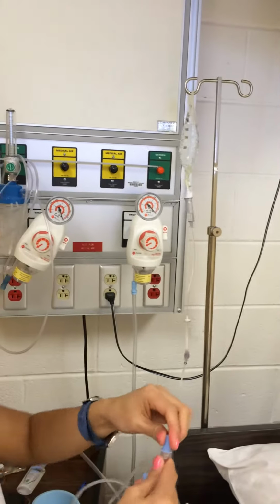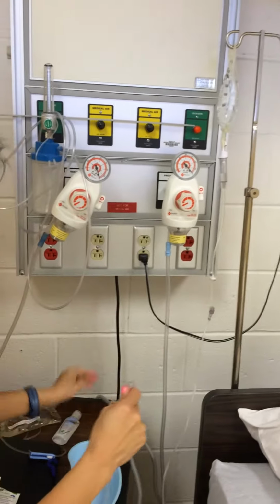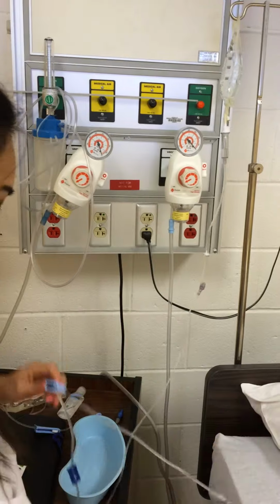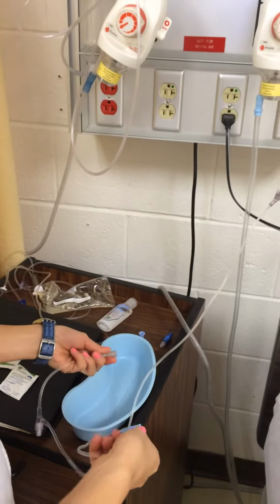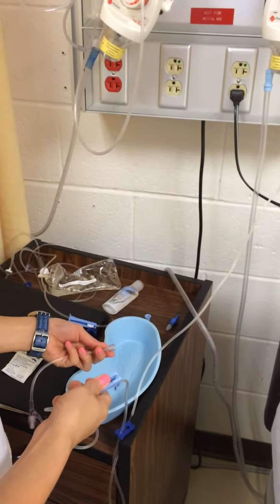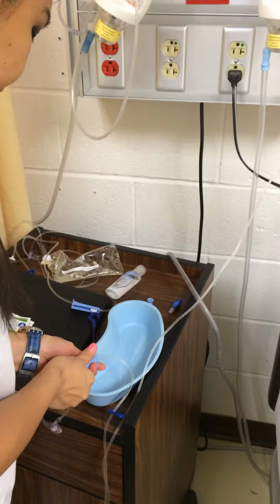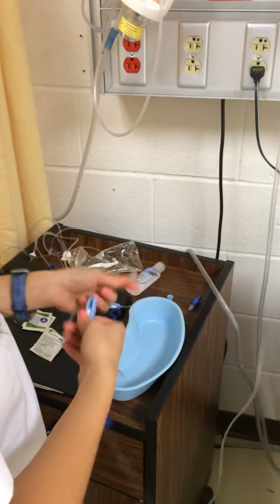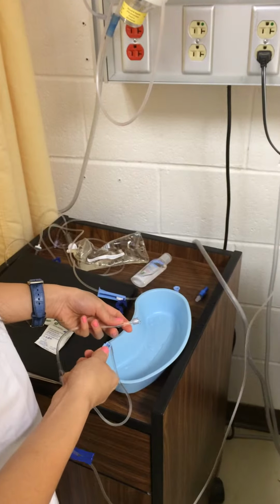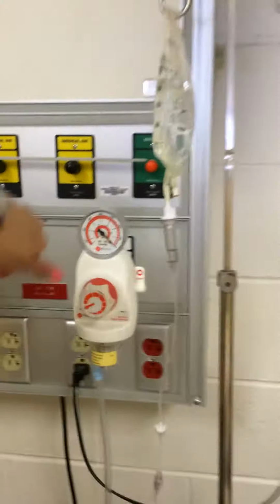Okay. I open it. So make sure there's no air. Oh, I have to unclamp it first. Okay. And I will do 15 drops per 15 seconds.